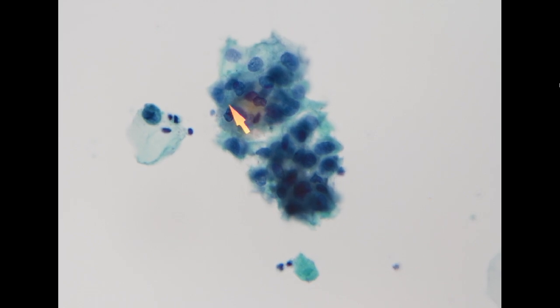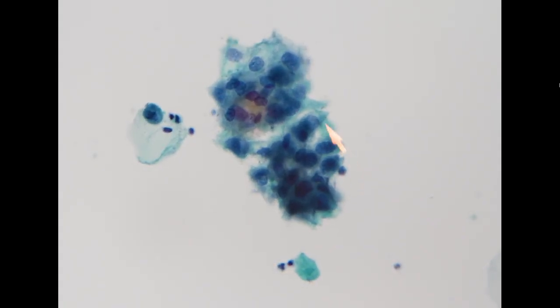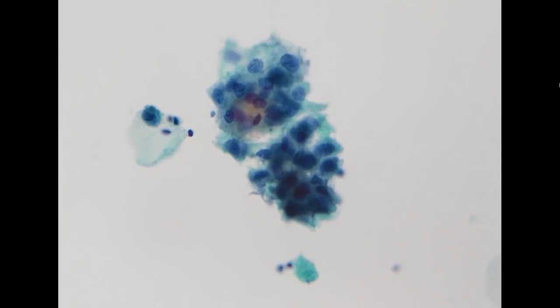So here again, we do see a few clusters of cells with increased chromasia and increased size of the nucleus. However, the NC ratio is actually not exceeding 0.5, and the chromatin pattern is not coarsely and irregularly granular. So for this case, we would call these negative. In the Paris System, the terminology is negative for high-grade urothelial carcinoma.